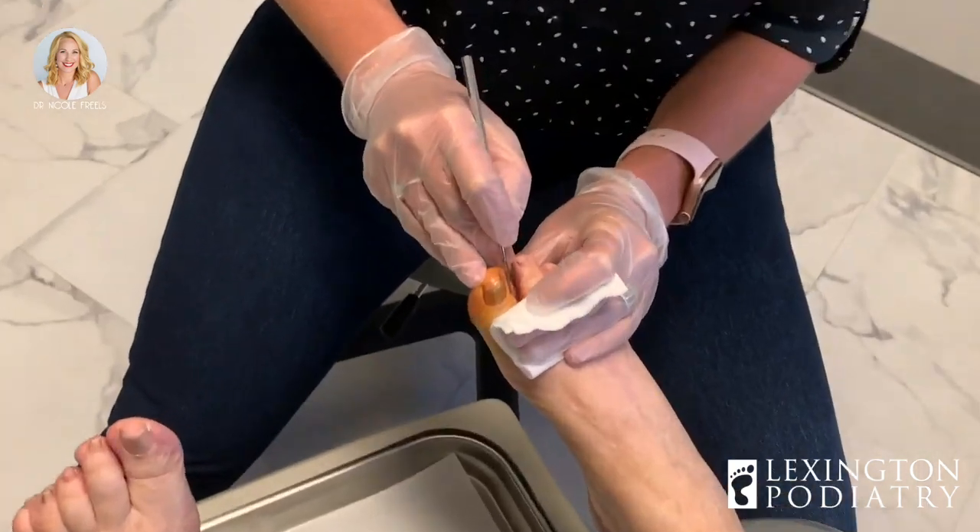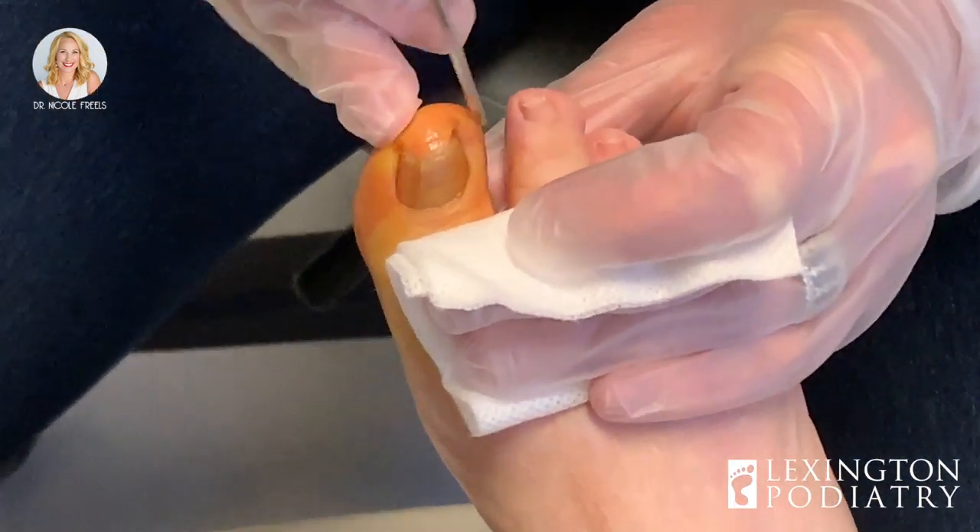Once we get in there we'll be able to express the fluid, which will feel significantly better, and then we'll remove the toenail that's digging in and causing the infection. I'll double-check first to make sure you're numb — I know you weren't looking forward to that part. How's that feel?